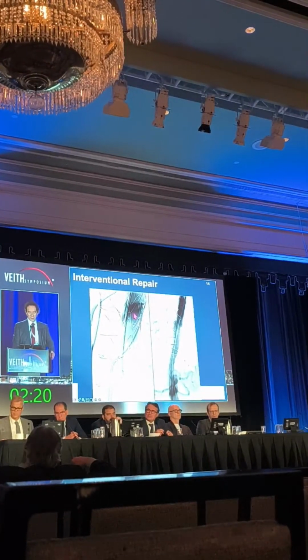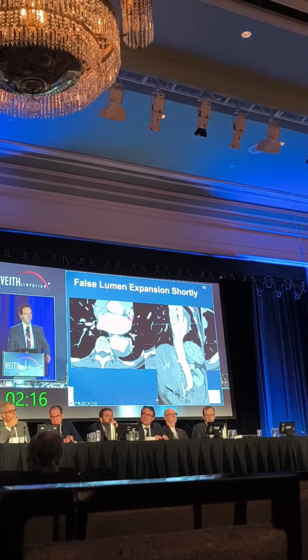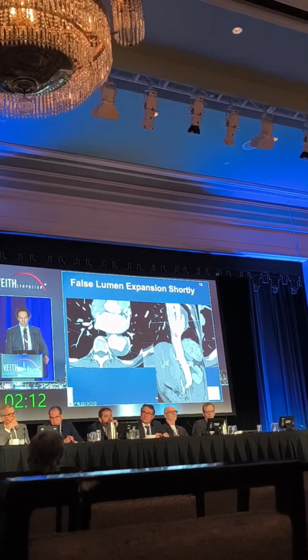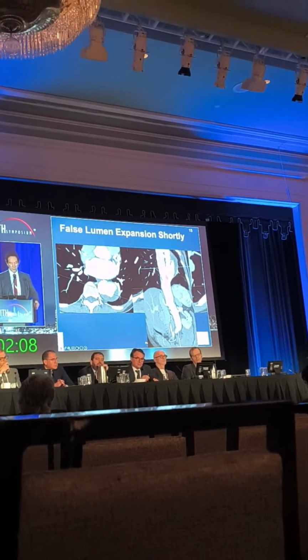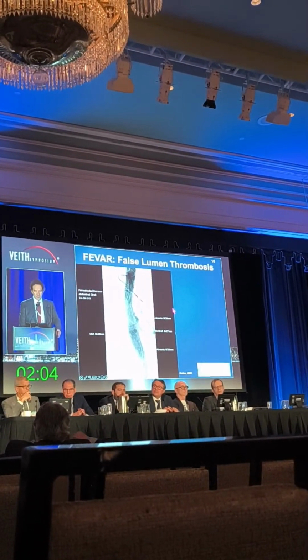But that patient came back later, in about a year, because she had chronic expansion. Despite that, we had extended down here closer to the celiac trunk, and then she got the classical repair using the fenestrated stent graft and then got a FEVAR here.